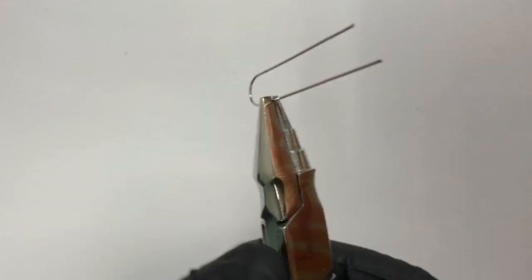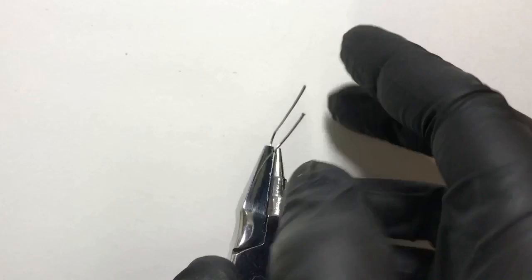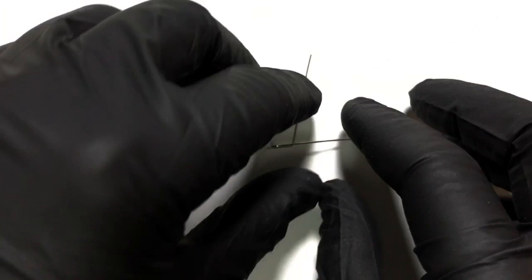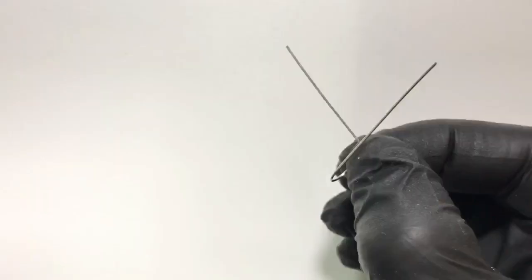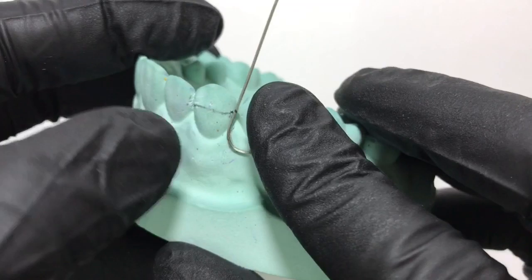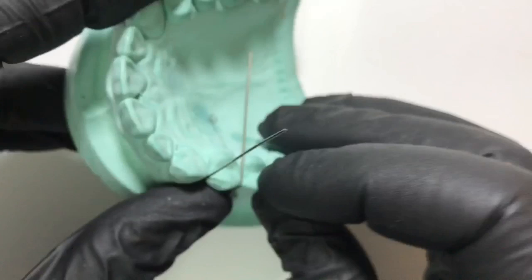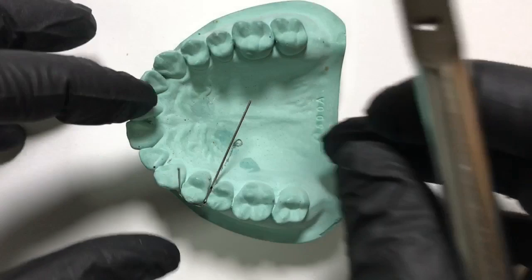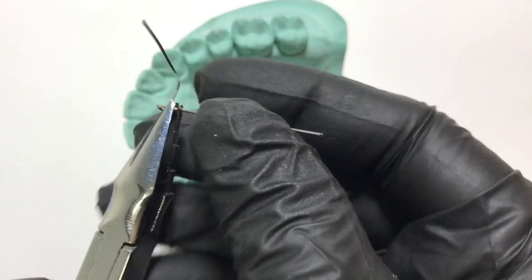First we will engage the point for the retentive arm in the rounded beak of the universal plier and give a sharp 90-degree bend. We then check its adaptation on the cast to confirm it is going correctly. Next we mark the point for the palatal adaptation, hold it in the rounded beak of the universal plier, and again give a sharp 90-degree bend, taking care not to distort the plane at any point.